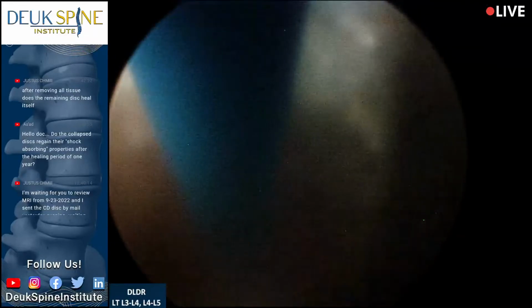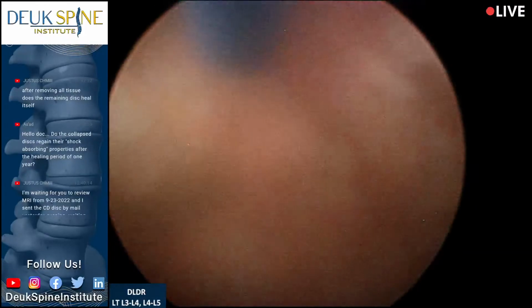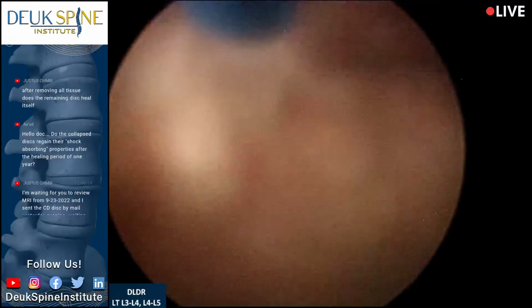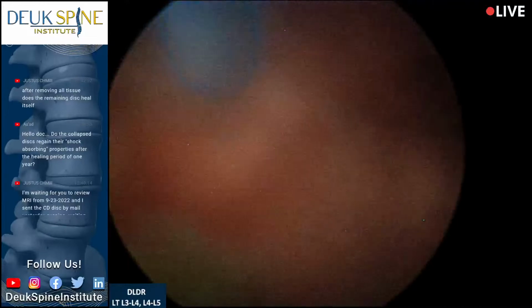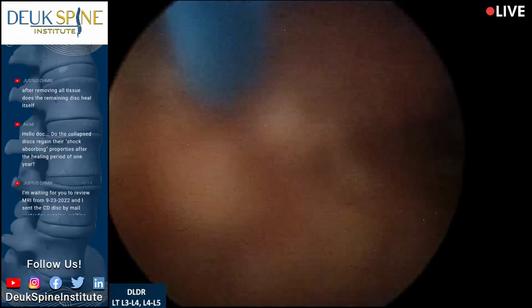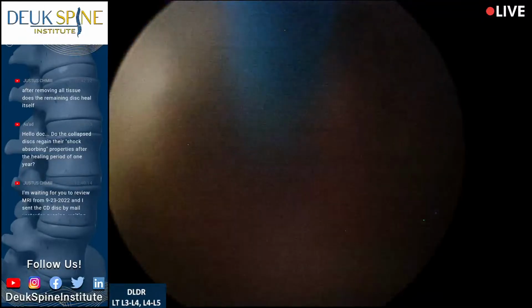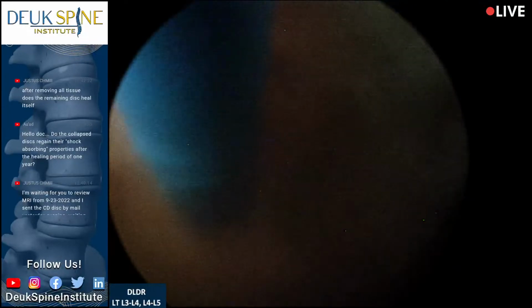We have another question. This comes from Justice, once more on YouTube. They asked, after removing all tissue, does the remaining disc heal itself? Yeah. So Justice, we're not removing all the tissue. We're literally fixing 5% of the disc is what you're seeing here. The other 95% we're not touching because it doesn't need to be touched. Only this small corner of your disc is where all the pain comes from. There's one on the right, one on the left at every disc in the back. So we're only treating about 5% of the disc by volume.